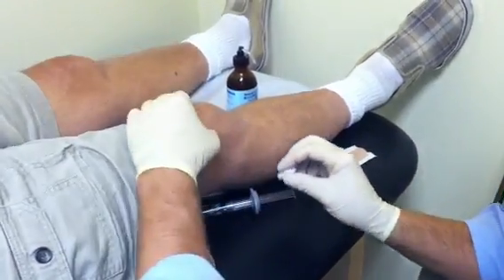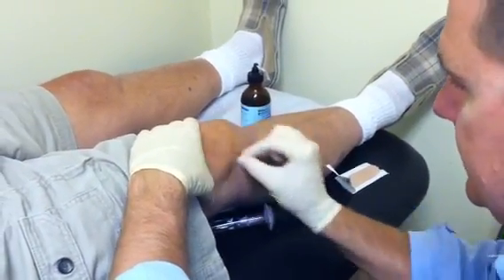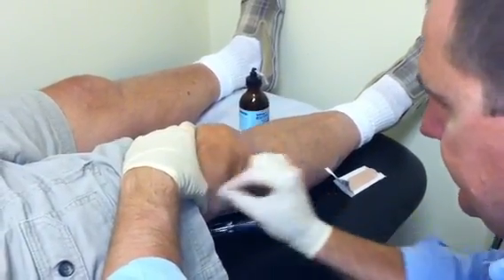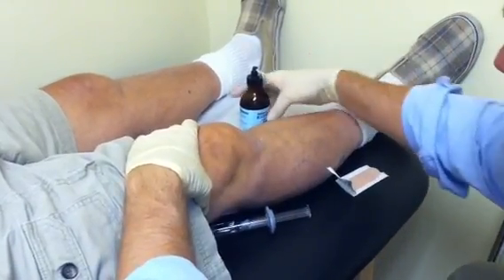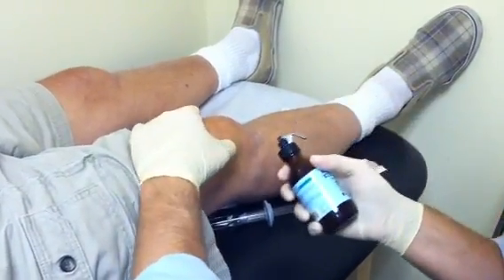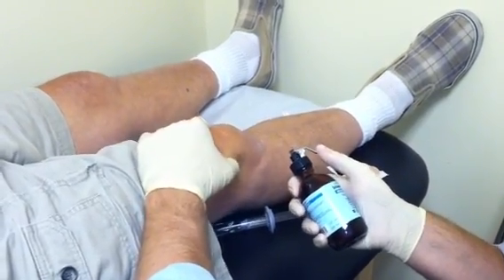So first what we do is we clean the kneecap real good with alcohol. We have some ethyl chloride here just to numb up the knee so that the needle going in has less pain.